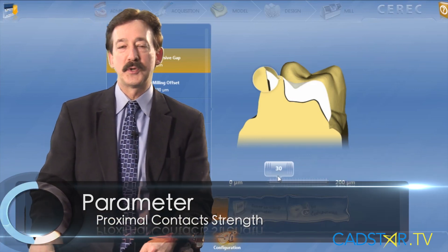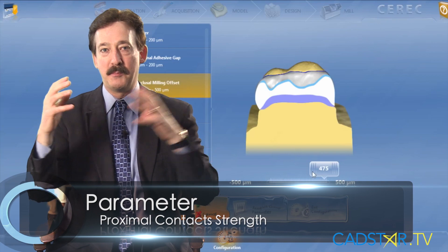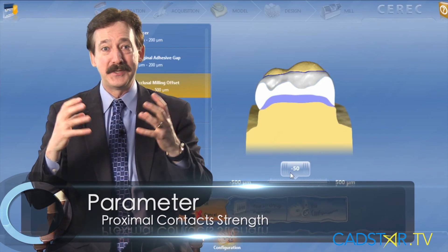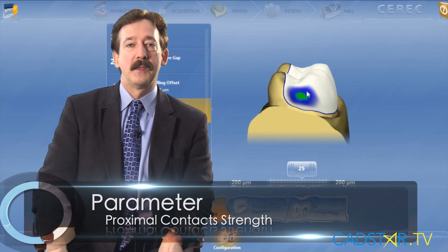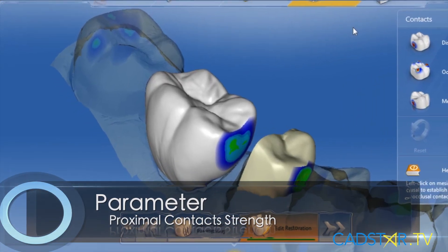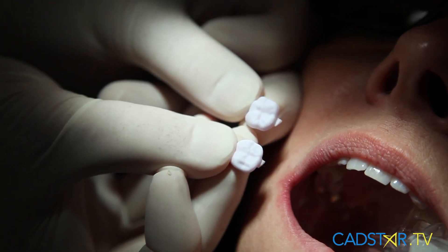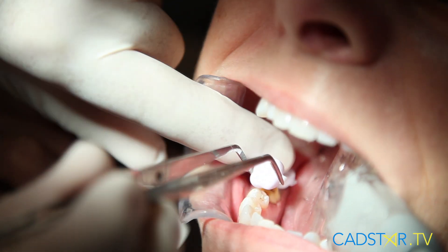Hi, my name is James Clem. We're talking about parameters — those metrics that help define our restorations as they mill, so they drop right in. We're talking about proximal contacts. My goal for a proximal contact is to have the restoration come right out of the milling unit, wash it off, and hopefully have a sprue on a non-contact zone so I can pop it right down.